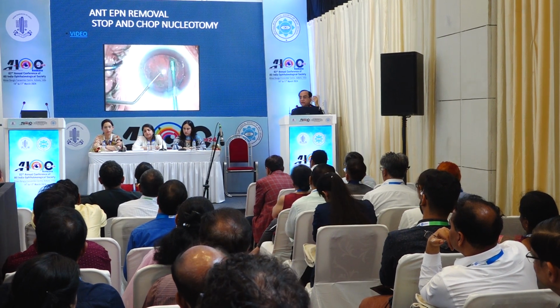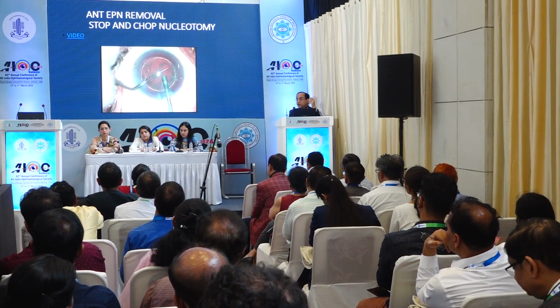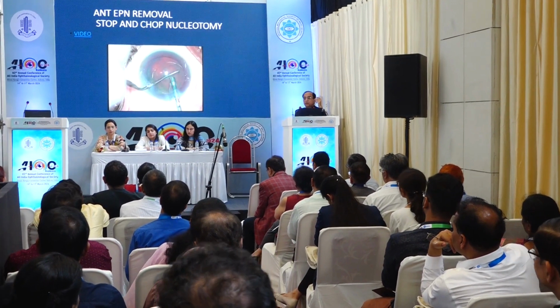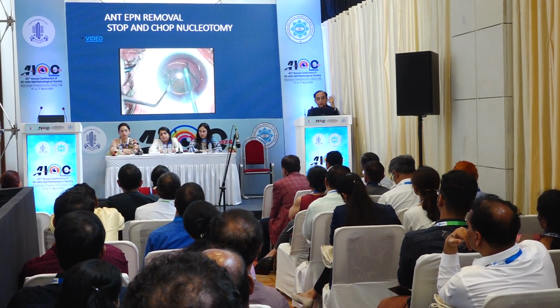So in a softer cataract, if you remove the rim of the epinucleus between the anterior capsule and anterior surface up to the delineation line, then it is possible to do the surgery on a low vacuum setting.